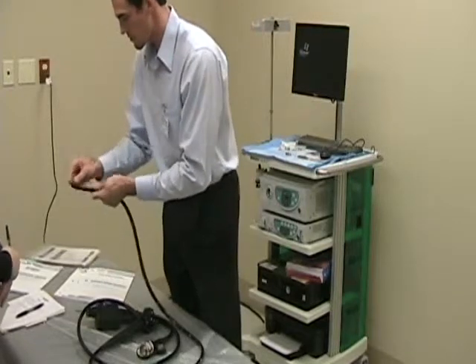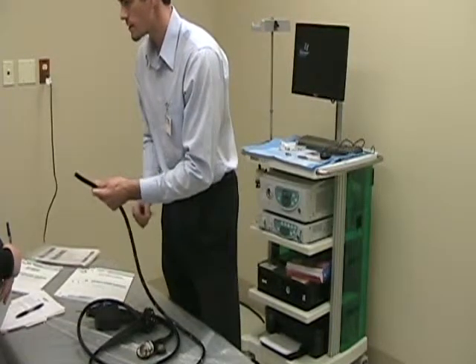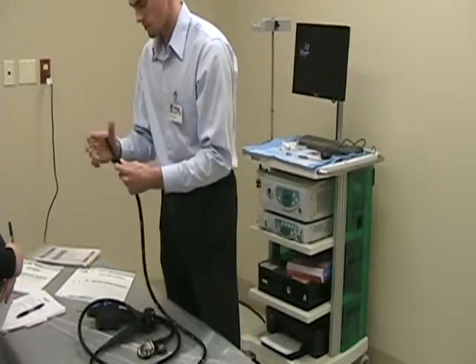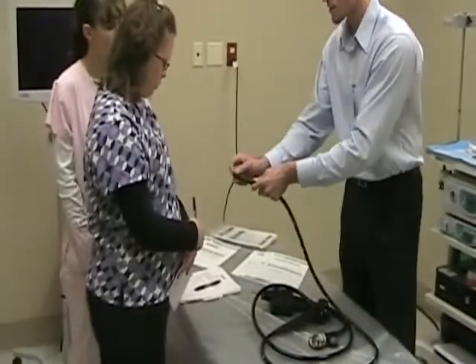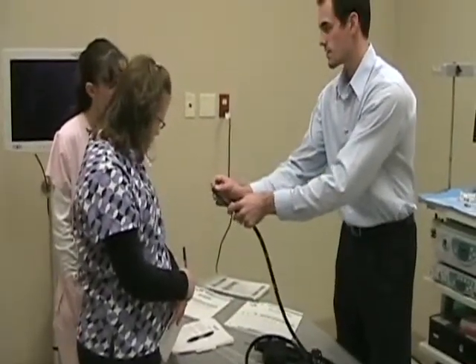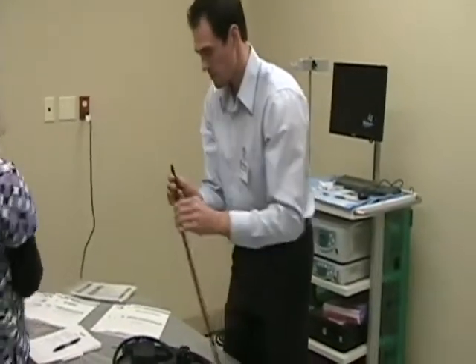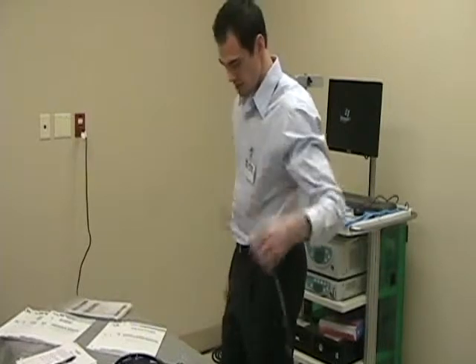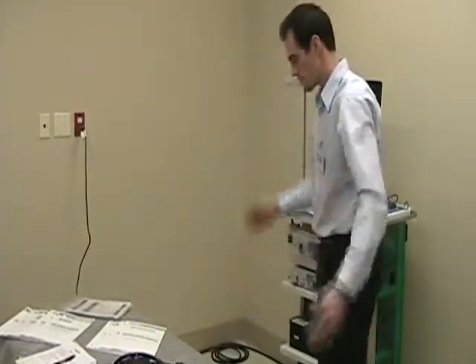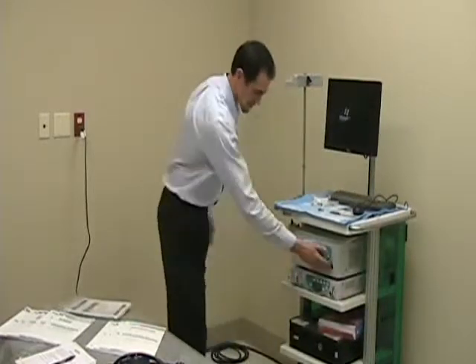And then of course the biopsy channel, which we just talked about, and then those two off-white are the headlights. You'll see how they work here in a second, and then the camera's located in the middle. And the jet wash is just off to the side of the nozzle. See that little hole? Okay. And then the EGD is everything's the same minus the jet wash. So, it's a pretty simple setup. That's pretty much the scope in general. We'll plug it in and get going.